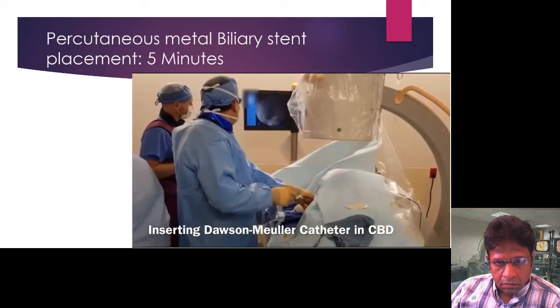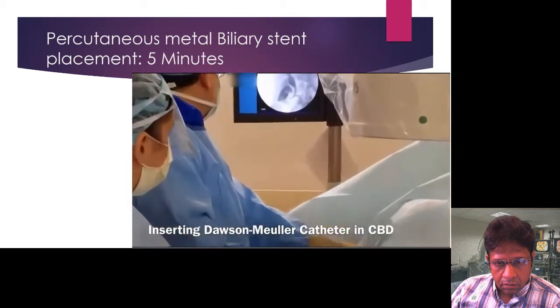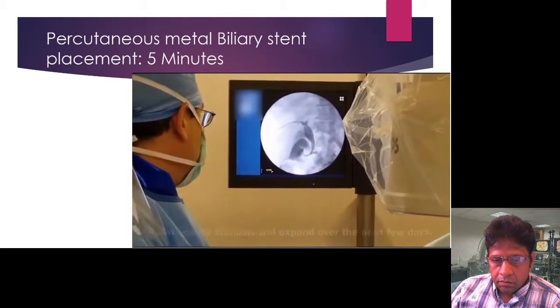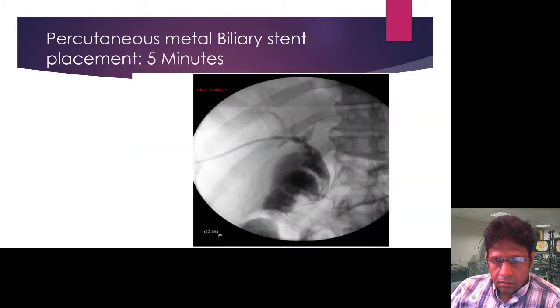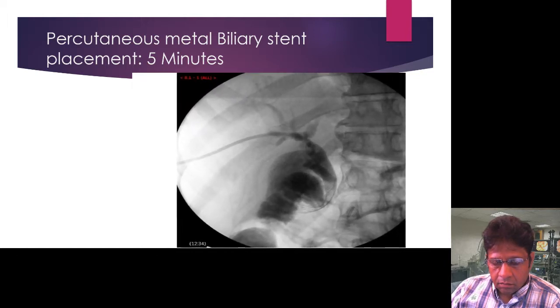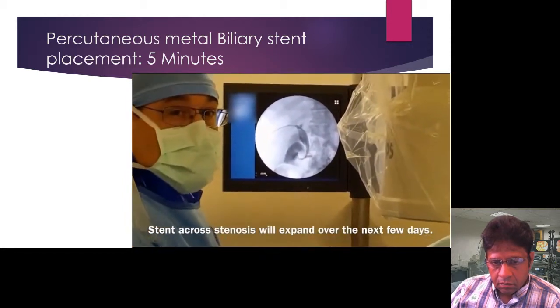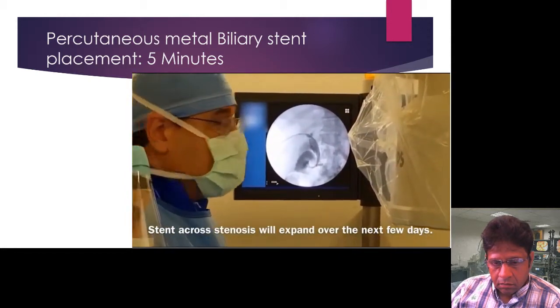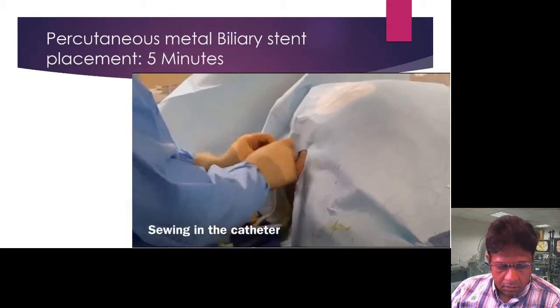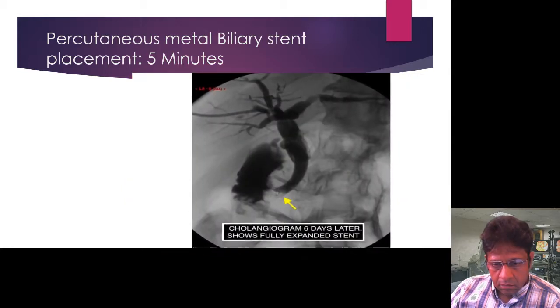Alright, so here you can see that the contrast is in the biliary system and is going through the stent nicely, so that's opened up nicely, actually. Remember when I started, there was basically no contrast able to get through that distal stenosis. Now it's going through nicely. And again, that stent should expand a little more over the next few days. This is capped. If something goes wrong again, we can just re-access that.